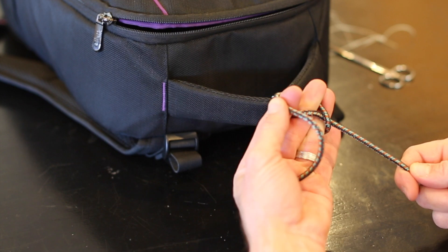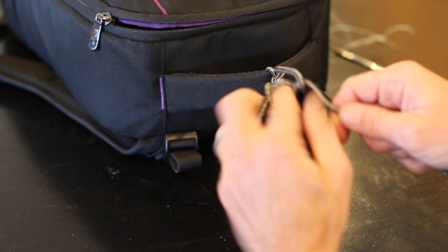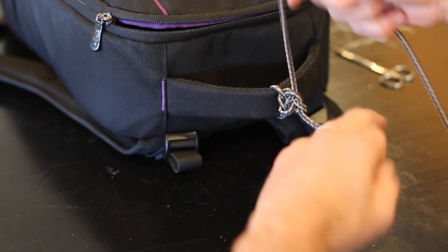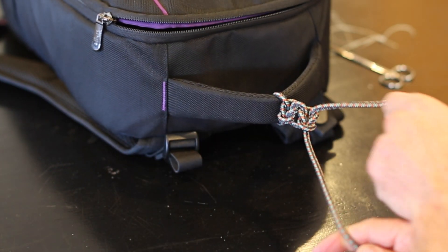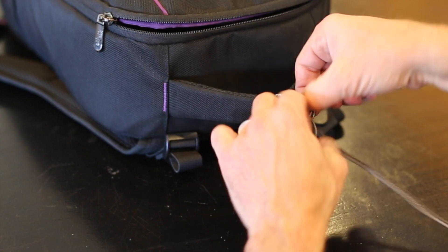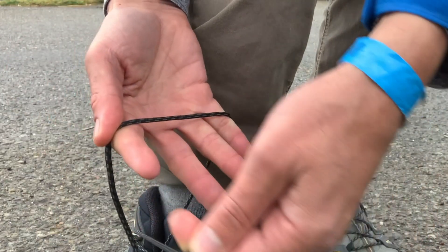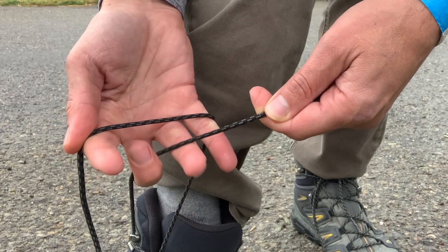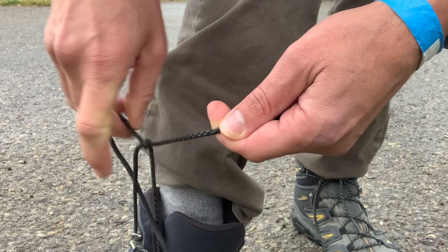For the one-handed tie: you cross over and bring it up, your hand goes down, and then you lay it on top of your two fingers. You do this tricky move where you catch it and bring it up, and then your hand goes up. You get the same result, but using just one hand.